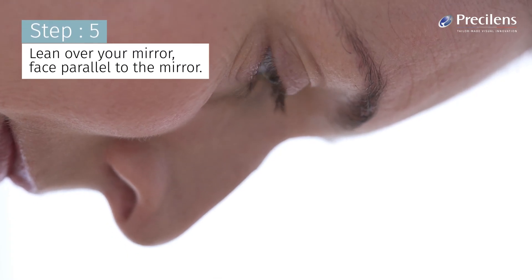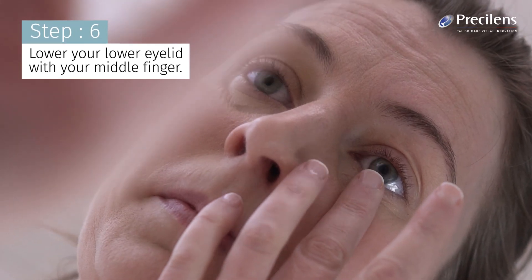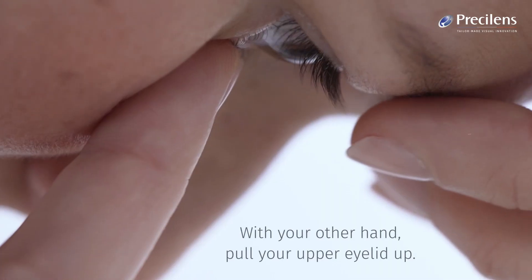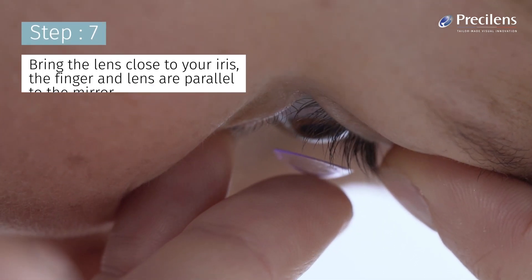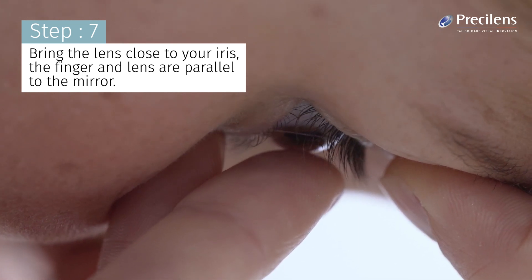Lean over your mirror, face parallel to the mirror. Lower your lower eyelid with your middle finger. With your other hand, pull your upper eyelid up. Hold your eyelids tight so you don't blink. Bring the lens close to your iris; the finger and lens are parallel to the mirror.